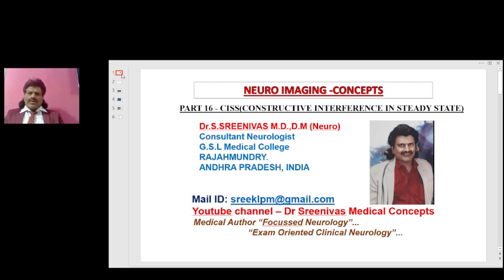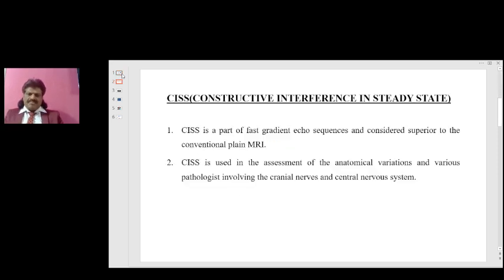We are continuing with the series of neuroimaging concepts. So today we are going to discuss constructive interference in steady state, otherwise known as CISS. Constructive interference in steady state, neuroimaging concepts, part 16.